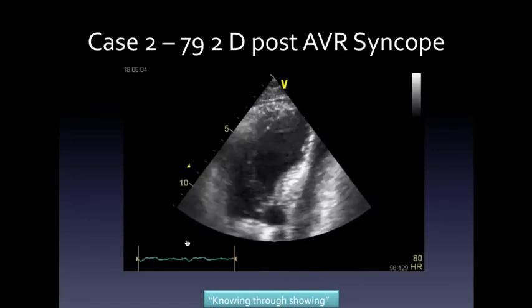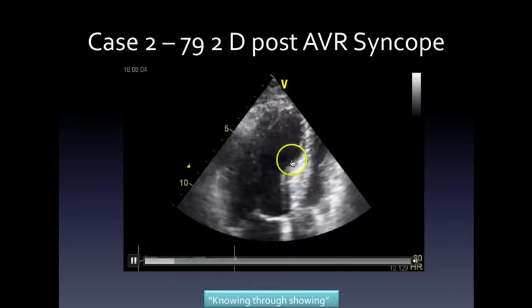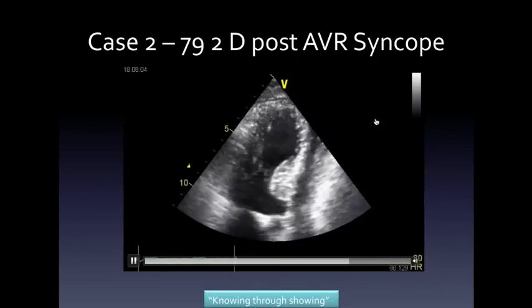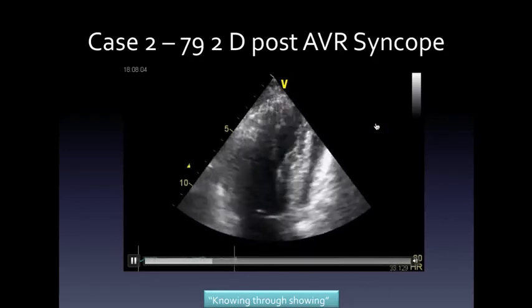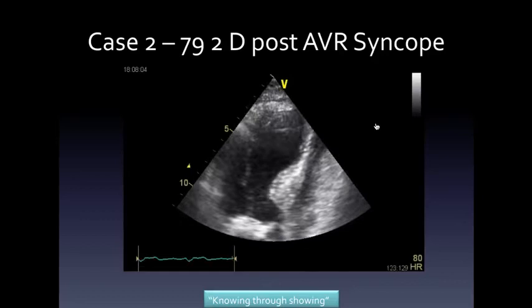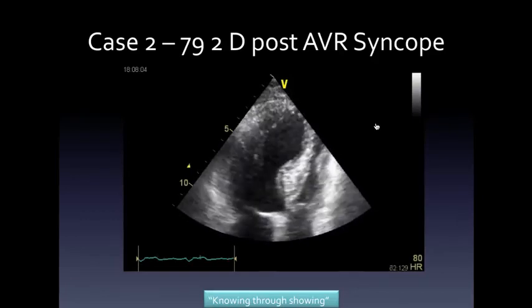Disconnected. Yeah, now that's a good point. So is it dyskinetic or dyssynergic? Dyssynergic. Yeah, it's a tricky one. So, the RV looks very small. Okay, and that's a very useful point to make. The RV looks small, but this is not a real four-chamber view, you see. So if you haven't got the view, you're not going to really be able to comment on the right ventricle.